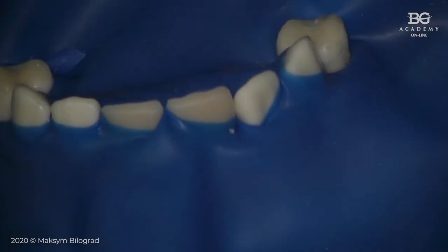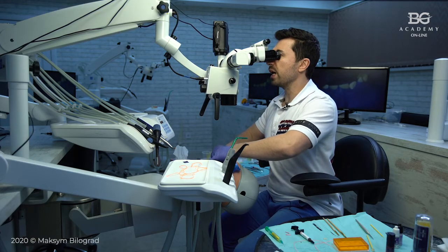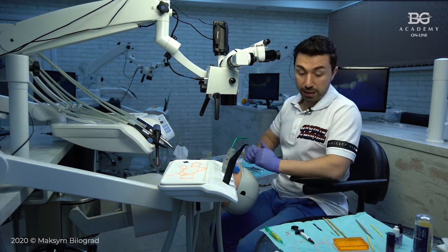Okay, and then we will take another rubber wedge. We take it from the rubber dam kit. Another rubber wedge to stabilize this part as well, and then we can put the frame. Okay, we can put the frame.